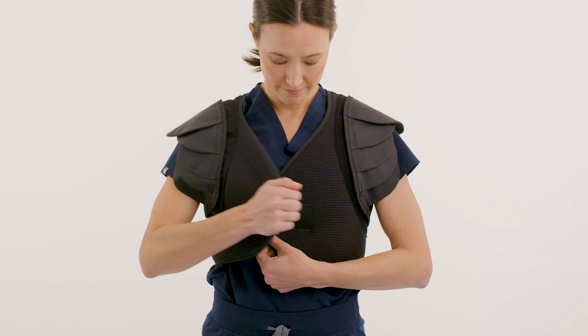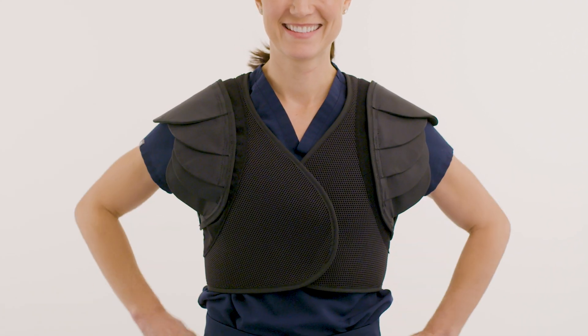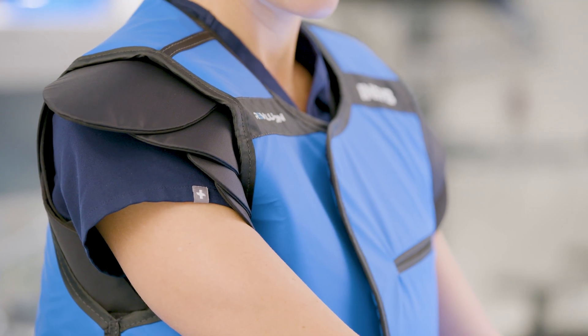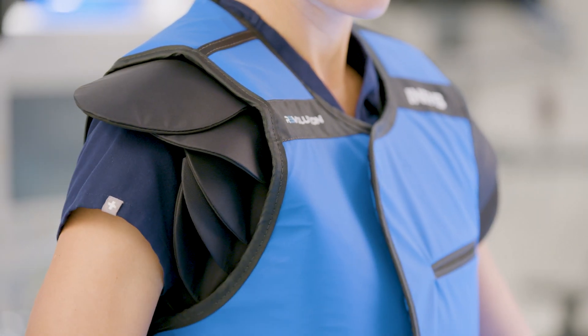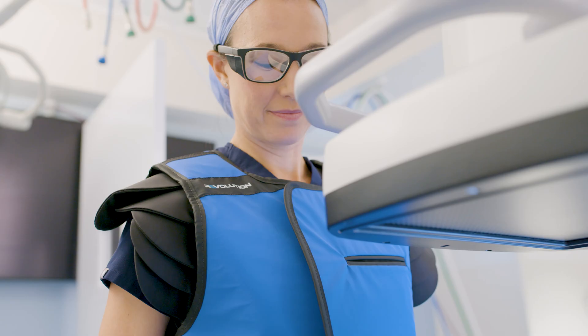I was looking for an option that was flexible and comfortable that I could wear in the operating room without being hindered while doing surgery, so I reached out to Infab and we collaborated on developing the Under Shield, which is a flexible, lightweight, layered protection that protects the upper outer quadrant and the axilla but also allows the surgeon full arm motion and provides protection regardless of the C-arm position.